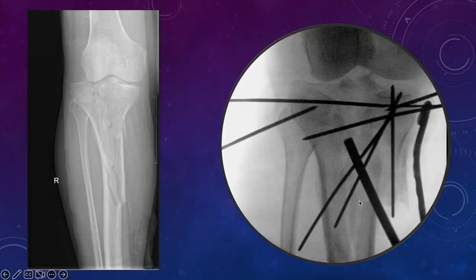You see here, we have made an entry from here to reduce the fragment because the straight instrument has to come in line with this fragment. Otherwise, if you make an entry from here, you will not be able to reduce it properly. You have to go in a lower part from where you'll be able to address this fragment. The fragment and the bone punch should be in a proper alignment. If your bone punch goes from this part, you'll be able to reduce this fragment.